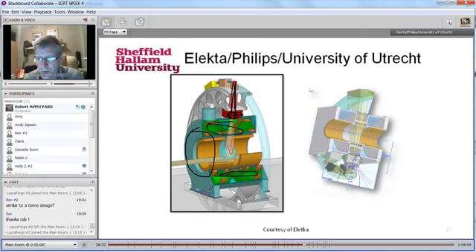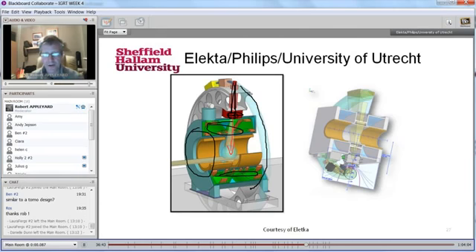And what you can see in light blue around here is a sort of toroidal opposing magnetic field. And the purpose of this is to minimize the fringe field effect of the MR scanner. For those that have been in an MR scanner, you will know that the strength of the field is still quite significant some distance away from the scanner itself. That's a bad thing with an MR-Linac, and you want to ensure that all the key parts of the Linac are away from the high field strength of this 1.5 Tesla magnet. We don't need to go into the physics of this, but this toroidal opposing magnetic field keeps all of these sensitive parts of the Linac safe and working correctly.